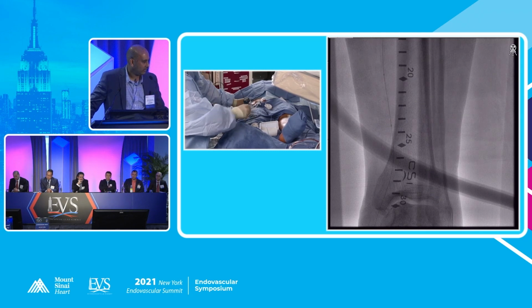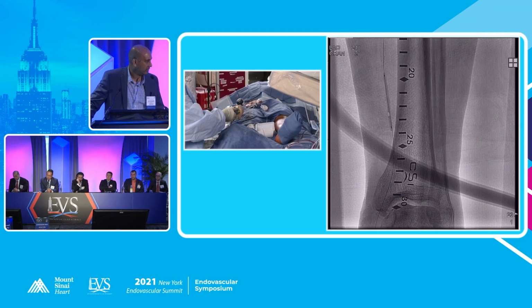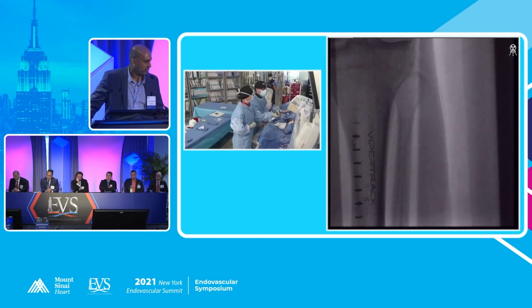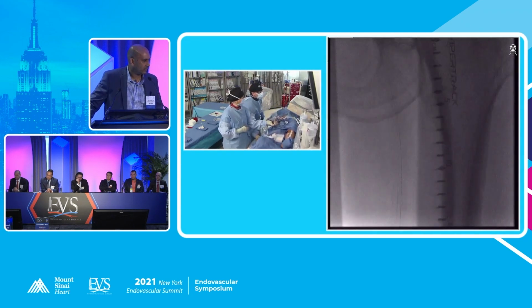I think it really depends on local expertise in terms of how we're going to tackle that common femoral artery lesion. I think a discussion with your surgeon is not a bad idea. Let's face it, the gold standard is still endarterectomy in good hands. And like Dr. Caroccio said, he can fix this under local, somebody that's had a prior STEMI and has bad cardiac reserve or cardiac disease.